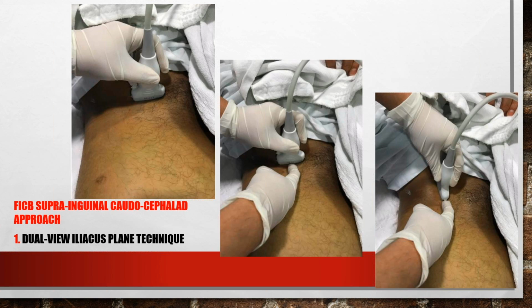They divide it into 2 techniques, one of which is the dual view iliacus plane technique. Okay, same as when we scan to do the femoral nerve, we position our probe. Before this, we know that there is the Mickey Mouse point and the snowman point. For this, we use the snowman point, and then from the femoral nerve, move the probe laterally until we reach where the iliacus muscle is the most superficial.